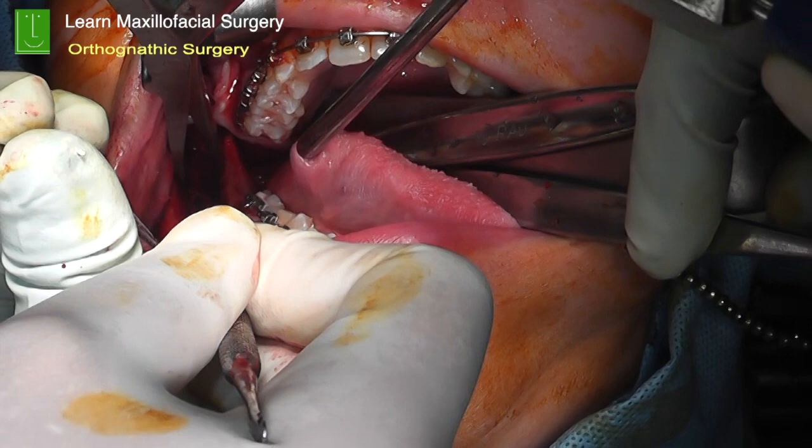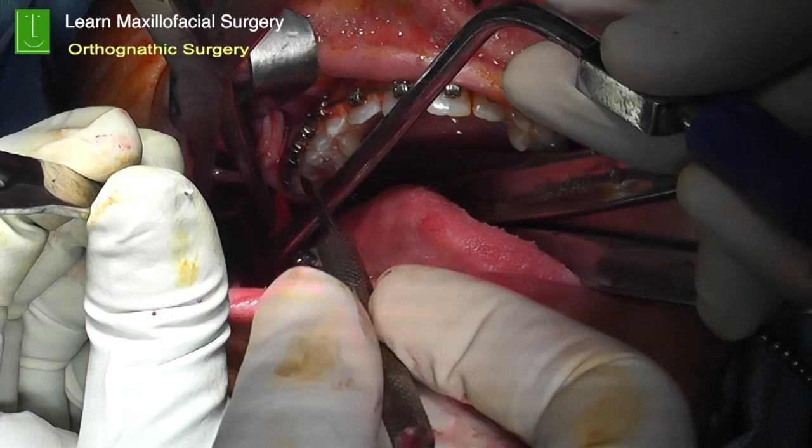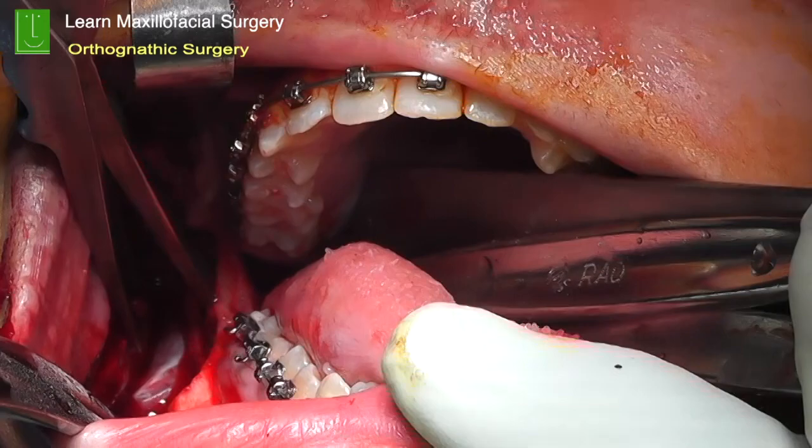At this point in time, it is very important that you identify the course of the inferior alveolar nerve. The neurovascular bundle is the key, and a lot of times it is in the proximal fragment. So this is very, very important. That means that it is in the fragment which has the condyle. Now the key is the neurovascular bundle has to be in the distal fragment. That's where you can see the neurovascular bundle there.